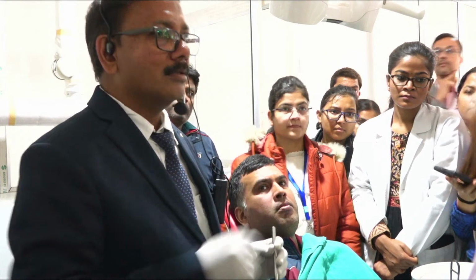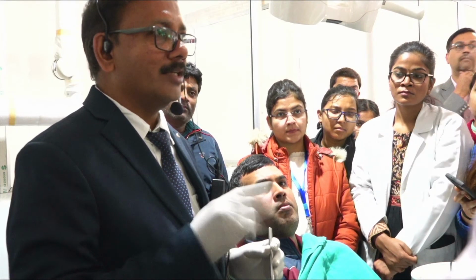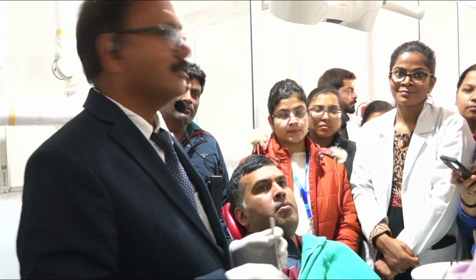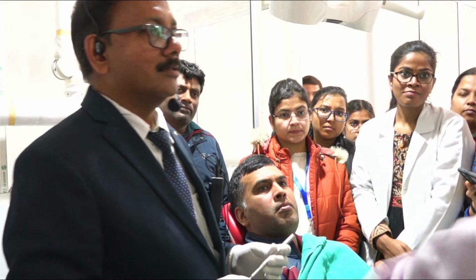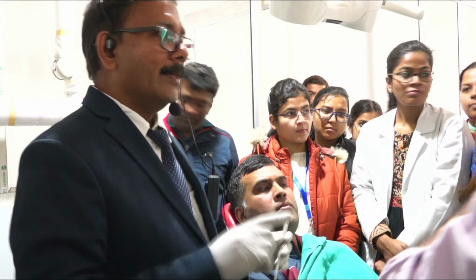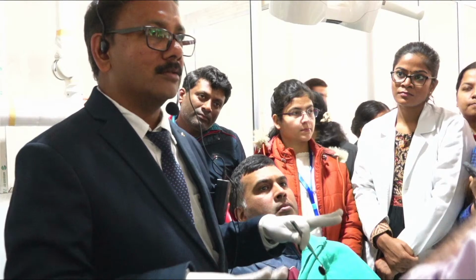But it is not an alternative to the burr drilling method. Don't rely completely on it. No, sir, I was just thinking for the ART. You can do it, because the microorganisms which are there are going to be killed. That's for sure.